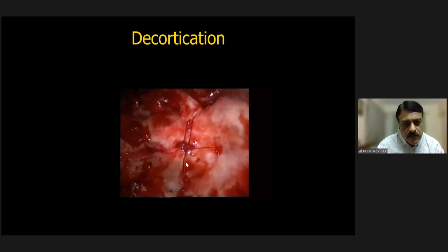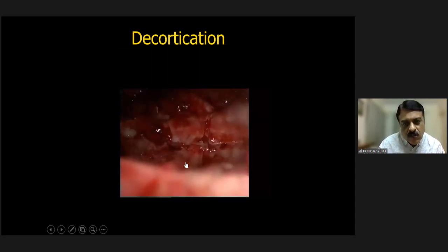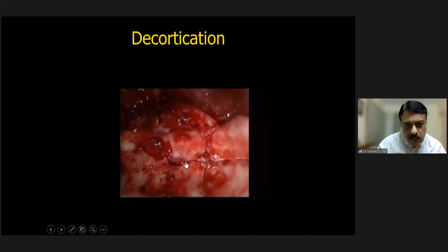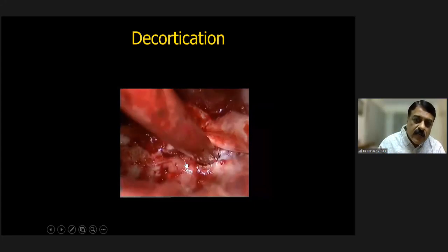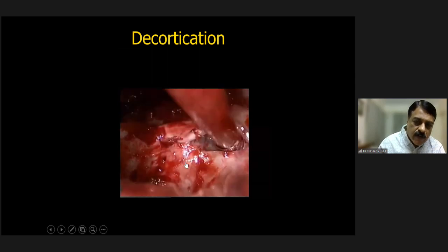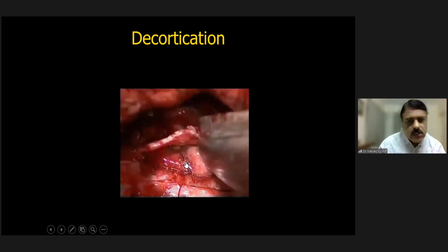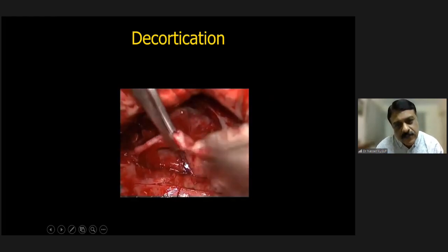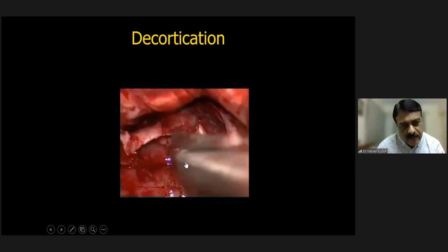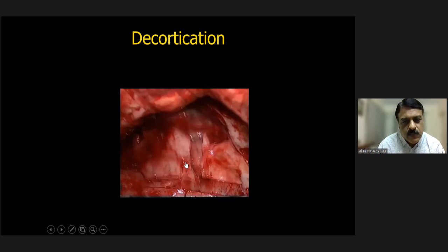Yes, I'll be talking over this video. The lung is trapped with a peel around it. This needs to be crisscrossed and opened, and it's a trapped lung. You've got to take it off, very gently, millimeter by millimeter off the lung. It takes about 3 to 4 hours, and a lot of meticulous effort is required to prevent air leak. And once air leak comes in, it is the bane of the patient as well as the surgeon.